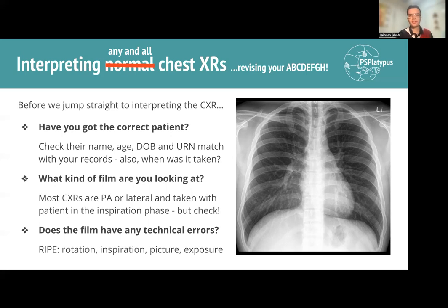Whereas if this is something that the patient has had for 2 weeks, 3 weeks, and they seem to be doing fine, that may reduce your threshold for red flags popping off in your mind, right? So you want to have a look at this X-ray, and if the previous one is available, have a look at when that was taken and what you can see there.